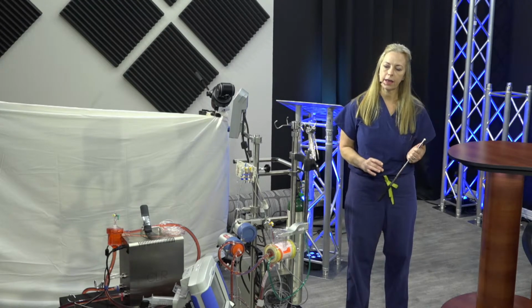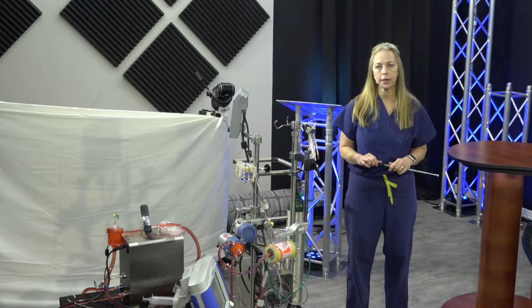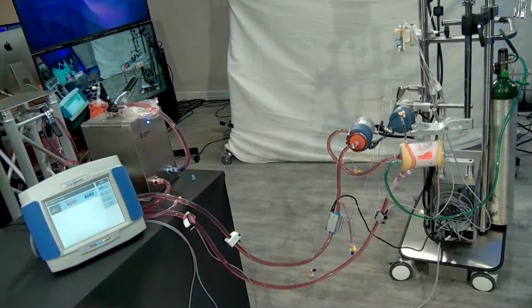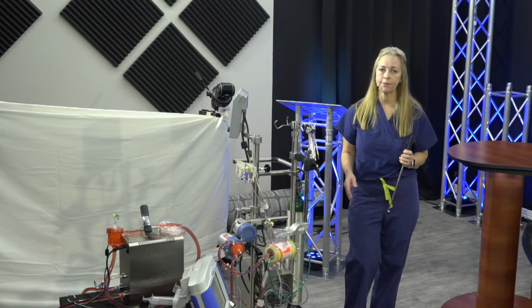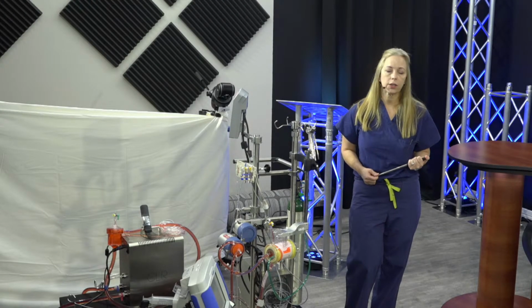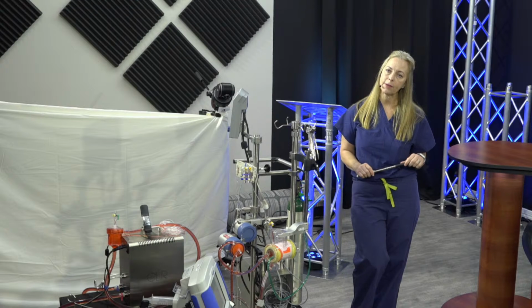Now, in addition to that, when you're first setting up your ECMO, you're going to hook up your ELSA meter, which can be done at any time, but let's say you know from the beginning you're going to be using this. You're going to input your patient name, demographics. You're also going to tell it, because oxygenators, depending on brand and type, have different priming volumes, so you'll need to know the priming volume of your oxygenator, and you likely already know that. You probably use one or two different oxygenators in your facility. And you're going to put in its priming volume.